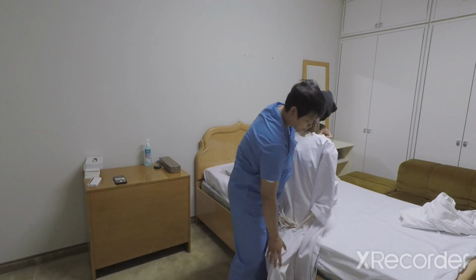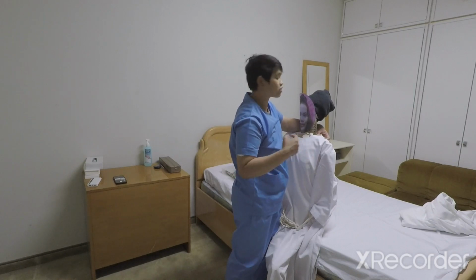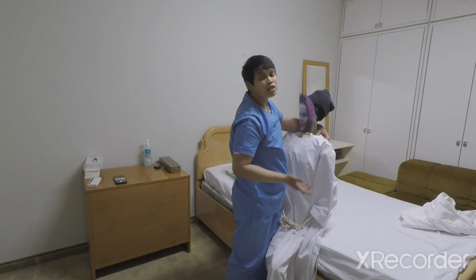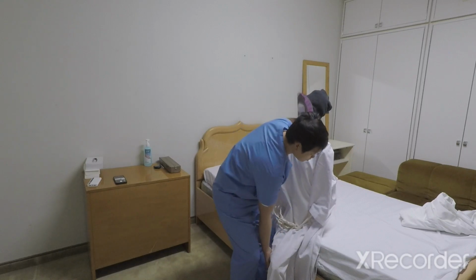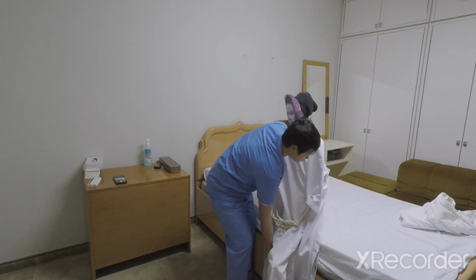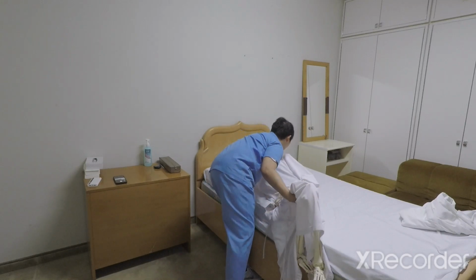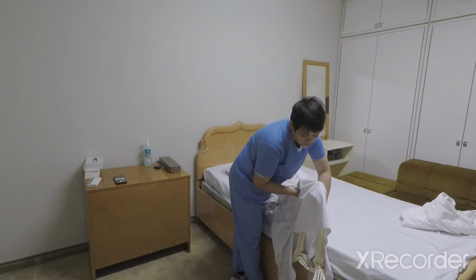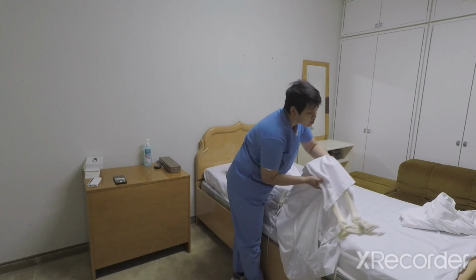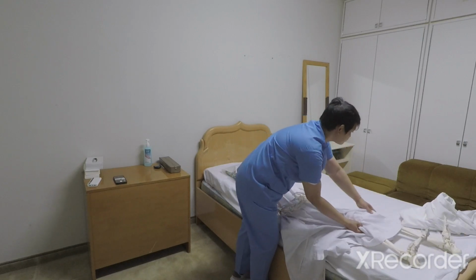After transferring her to the bed, just let her sit for a while. Ask her if she's feeling dizzy. If not, we can proceed going to the bed. Side, lift up, and side. Then, help her with the legs to extend.